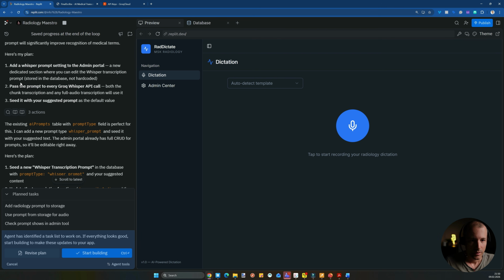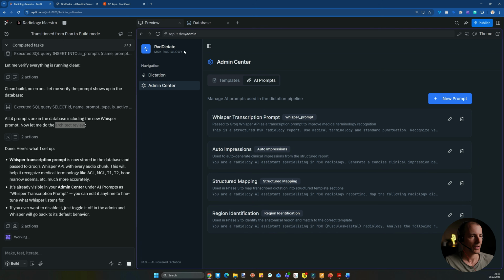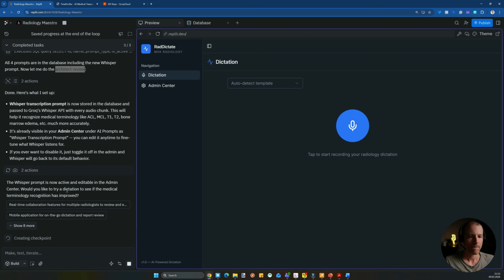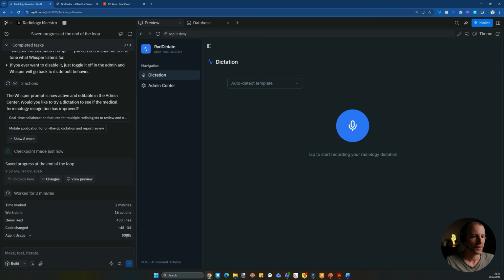So let's see. Here's my plan. So let's go to the admin center. We have now the AI prompts: Whisper, transcription prompt, auto impression, structured mapping, and region identification. So we got a couple of prompts here already. That's good. So let's see. Yeah, so this is done. Okay, so it cost us 80 cents to actually implement. So let's try.